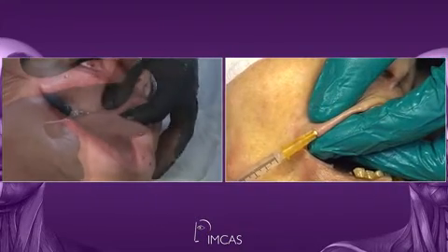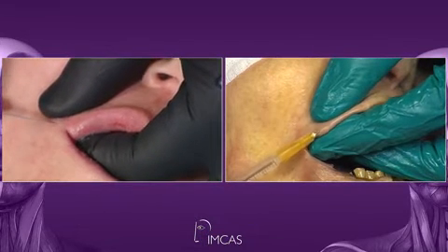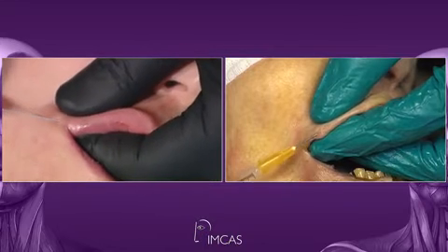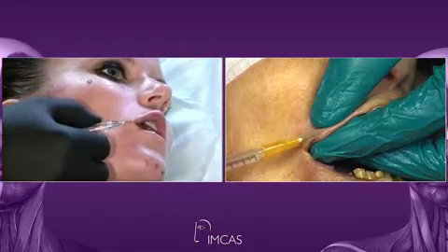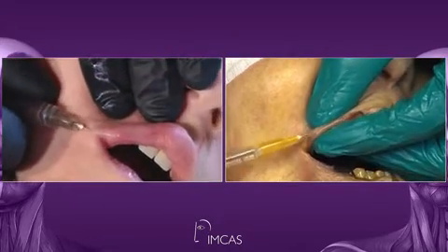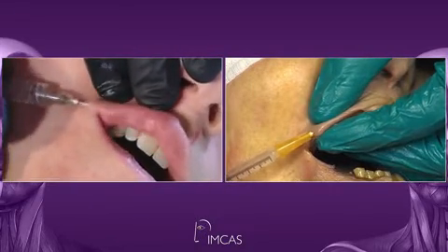And then as the third layer, with the cannula, as I described previously, I can feel the different layers of the tissues. So I feel resistance when I go through the orbicularis oris, and that makes it my three-dimensional GPS. So now we're actually on the other side, and adding volume here, we can see will help to evert the lip more.